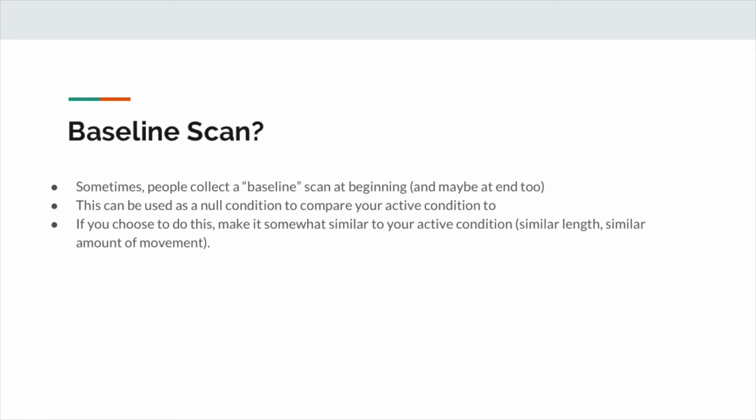So if you're choosing to do a baseline scan, make it somewhat similar to your active condition, with similar length and a similar amount of movement that the participant's going to be going through, so that you can meaningfully compare it to the condition you care about later on.